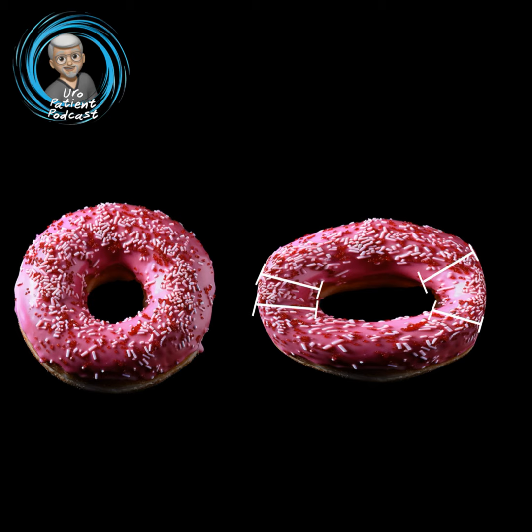So here's actually what our system looks like. The scope is inside the patient right now, and actually you're looking all the way through into the bladder. The first thing we're going to do is fill up his bladder with some water to try to get it out of the way. It's all done under that previous anesthetic that we talked about. We're still looking into the bladder. Now we're coming out of the bladder and into the prostate. That's the whole key right there: you want to find the areas of the prostate that you can tuck back. You don't want to be too close to what we call the bladder neck. So that's coming back. And you can see he is getting lined up.